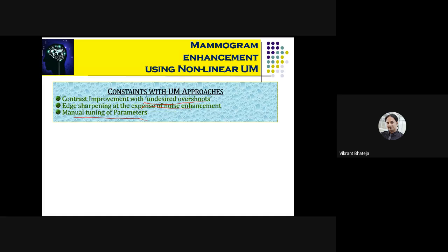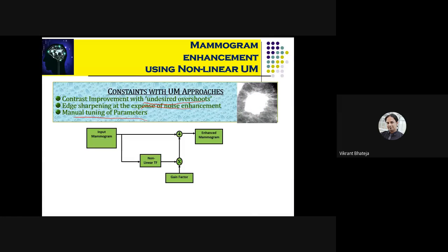So a very good place to change the function is this: in the conventional unsharp masking algorithm, we should replace the high pass filter by a non-linear transformation function. I mean the new sigmoid function, which we took up in the initial part of our preliminary results. We can add it to the conventional block of unsharp masking and replace it with the new, improved sigmoidal function, and there is a considerable change in the results which are seen.